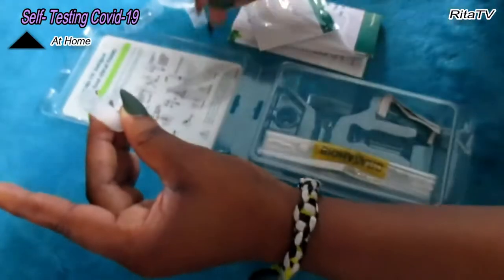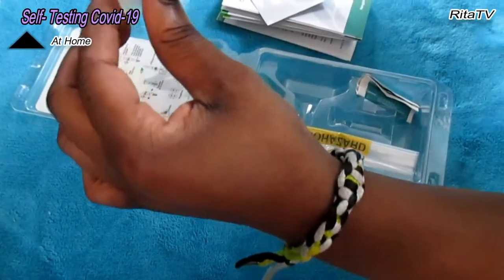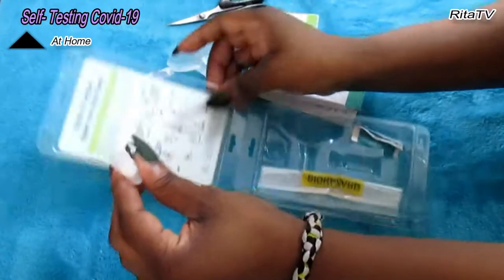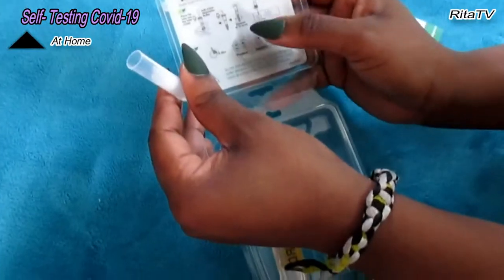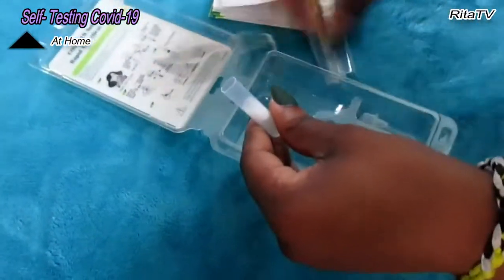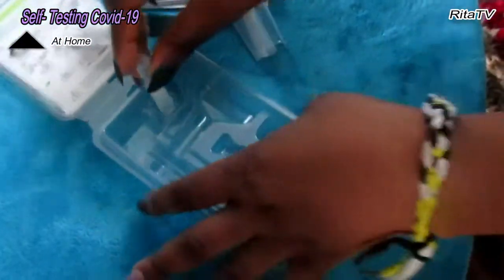So what's the next thing? Squeeze 10 to 15 times. So now we're going to squeeze this 10 to 15 times. Okay, what's the next one here? Then you have to cover it using the cover. Yeah, okay. So you're going to cover it with this, so we'll place it on this place there.